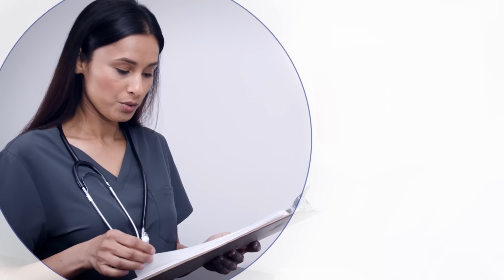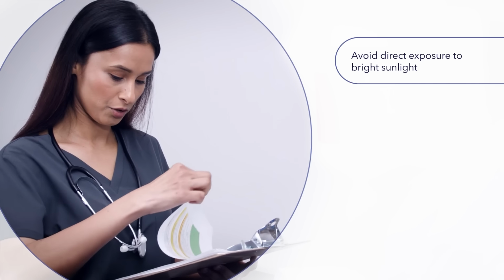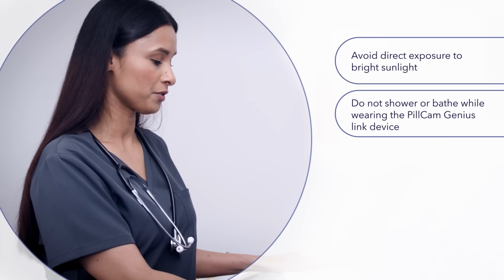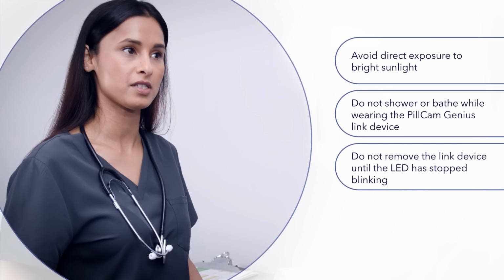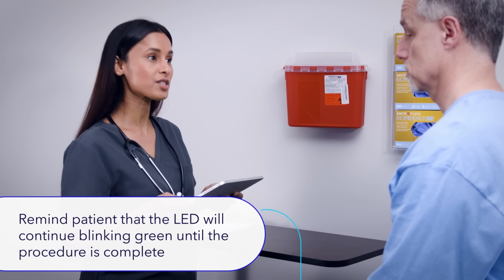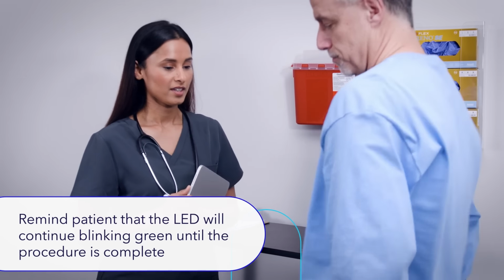Remind your patient about post-ingestion limitations, including: avoid direct exposure to bright sunlight. Do not shower or bathe while wearing the PillCam Genius Link device. Do not remove the Link device until the LED has stopped blinking. Follow the guidance on physical activity limitations. The patient will now leave your office with a full list of specific instructions for the remainder of the procedure.